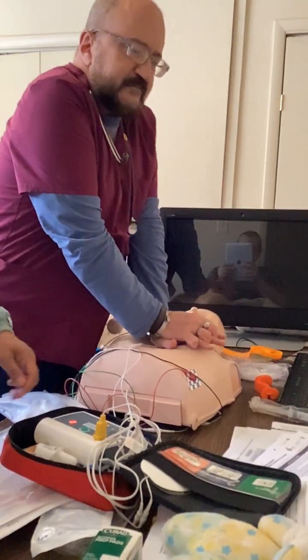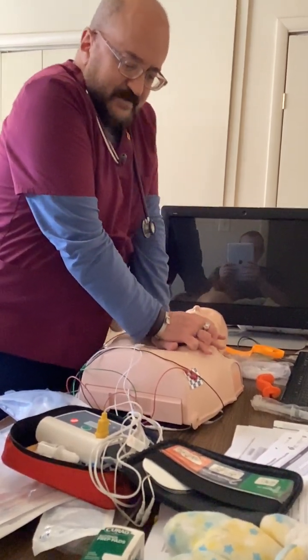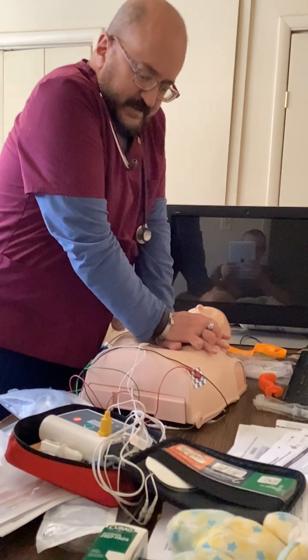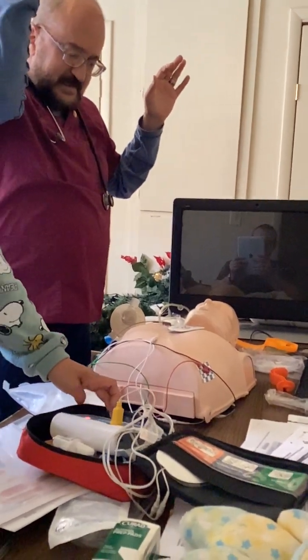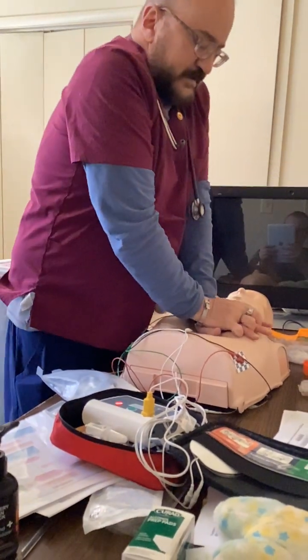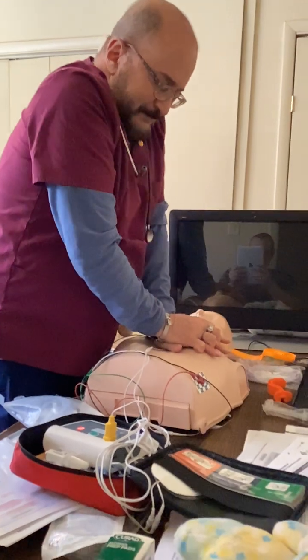Charging. Stay clear of the patient. Clear. Deliver shock now. Press the orange button. And remember, when you've delivered the shock, when you defibrillate, you start CPR. Begin CPR.